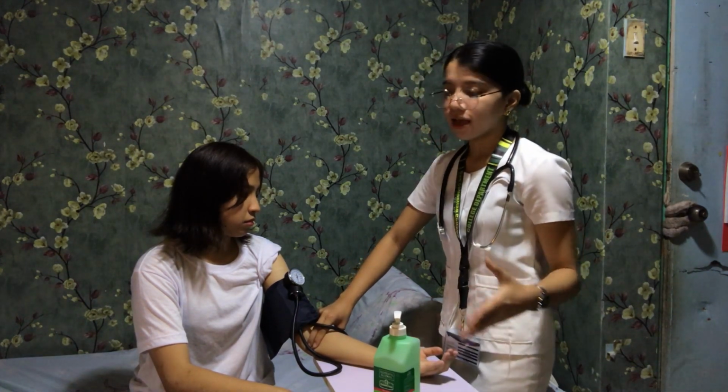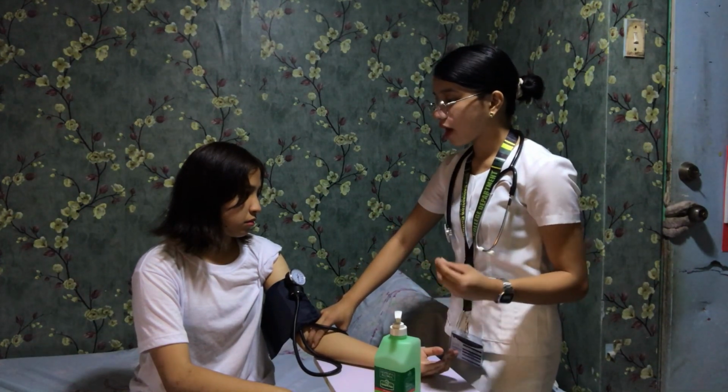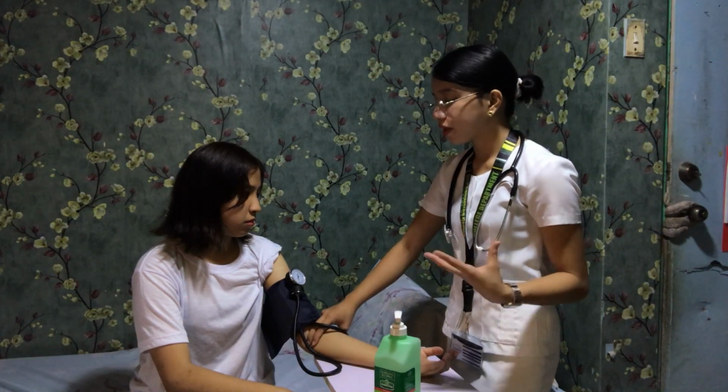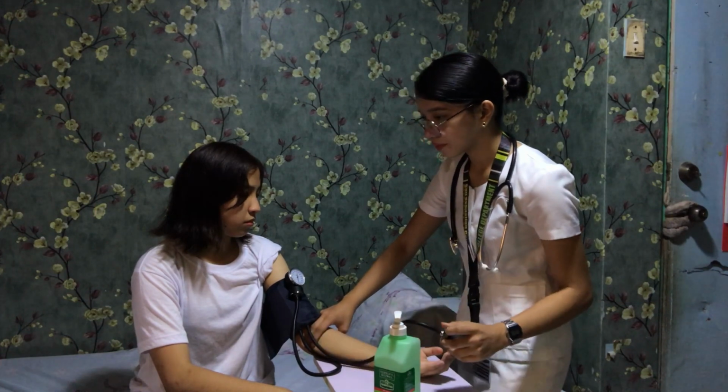Alright, since I have found her brachial artery, I'm going to start inflating the cuff until I no longer feel her brachial pulse. Okay, I'll start now, ma'am.